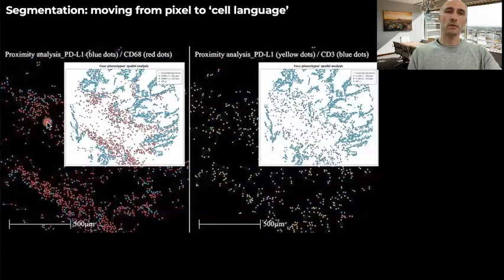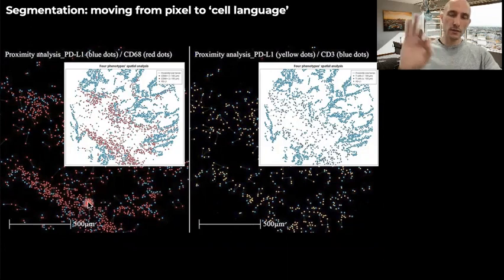You and the software are speaking the language of objects. And then, as I mentioned, we did a lot of analysis. This is only an example where you can see the proximity analysis we ran. This is a proximity analysis for CD68 positive cells, and this is a proximity analysis for PD-L1 positive cells. This is a real image we had, and we don't show the markers here. What you have here is what the software recognizes. I know it's difficult to see, but you have small dots connected in here, and this is what the software did to detect the cells within 100 microns and 200 microns, as I showed you in the previous slide.